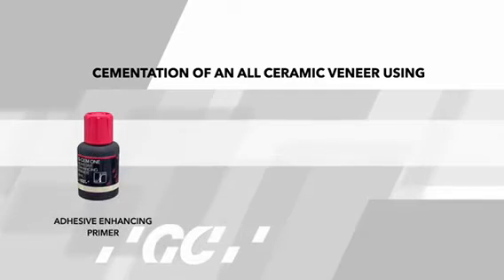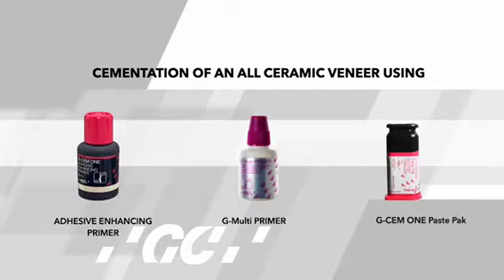This video shows us the cementation of an all ceramic veneer using G-CEM ONE.